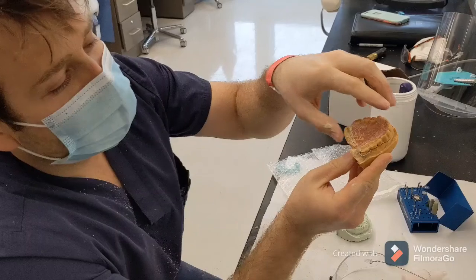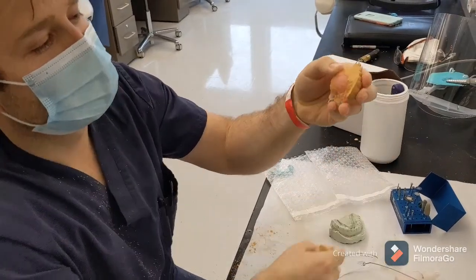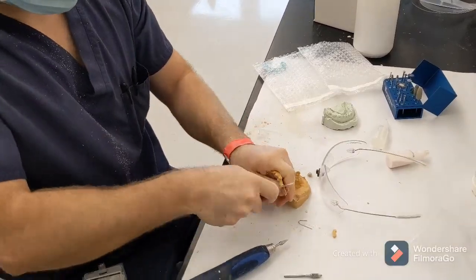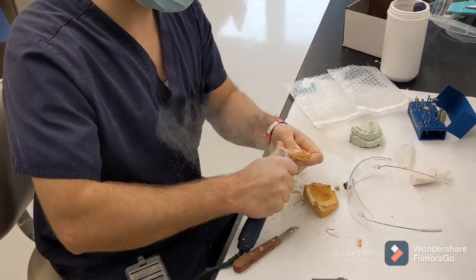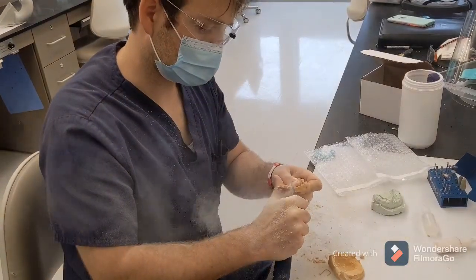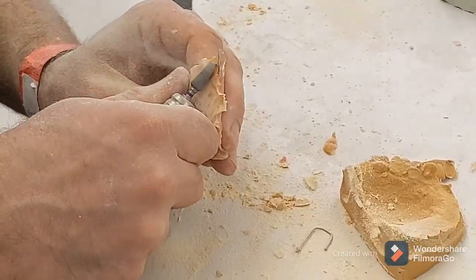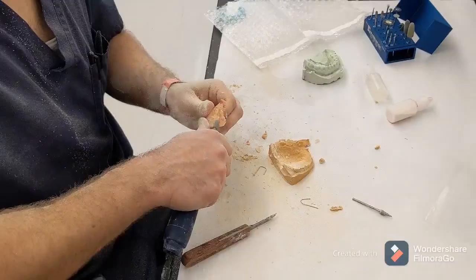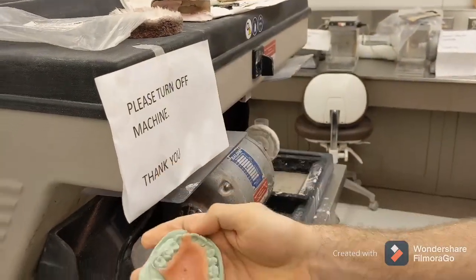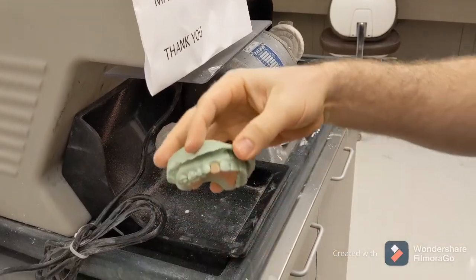Not enough separating agent. Here's what it looks like — we've recovered it from the other cast.